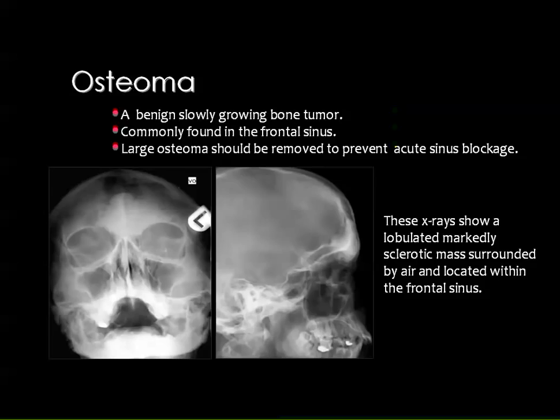the osteoma. And the osteoma is the ivory solid osteoma without a cancellous or medullary cavity. This is a very frequent finding in the paranasal sinuses, especially in the frontal sinus. It can be diagnosed by the plain X-ray.